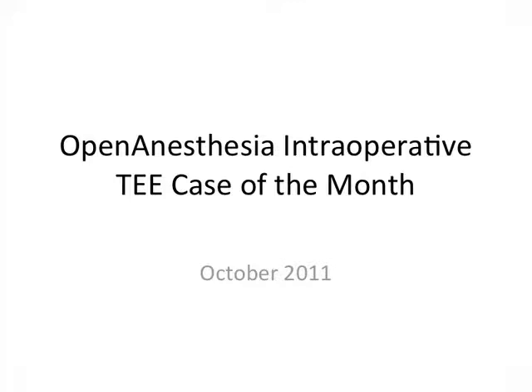This is Dr. Julie Huffmeyer with our Open Anesthesia intraoperative TEE case of the month for October 2011. Each month we feature an operative case which teaches or emphasizes an important aspect of basic intraoperative TEE.